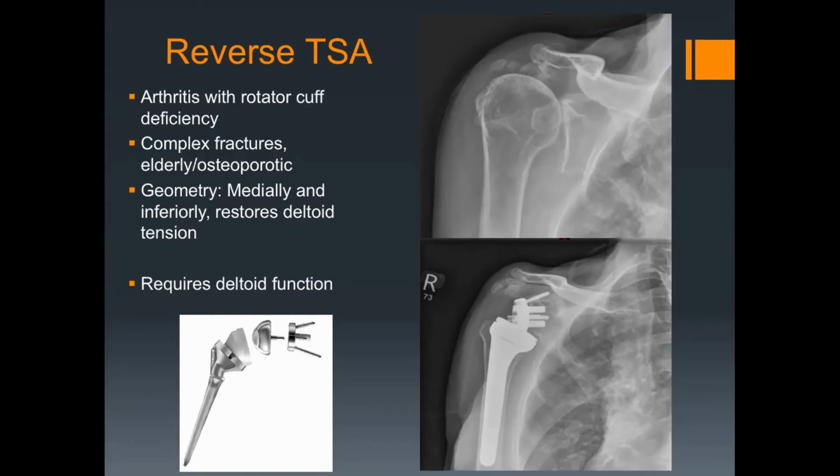And the other thing is just how high this has gone, because the relevance to us is that we're bringing him down to the bottom of the socket, about 3 or 4 centimeters, which may be beyond what your brachial plexus can tolerate.